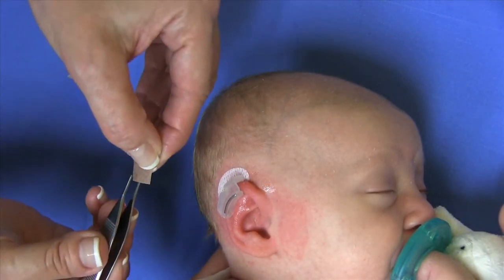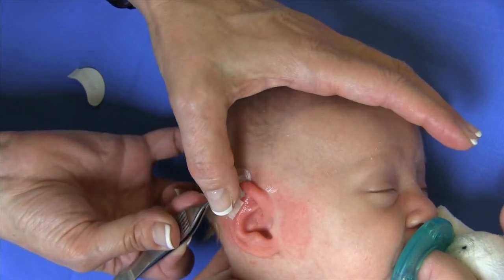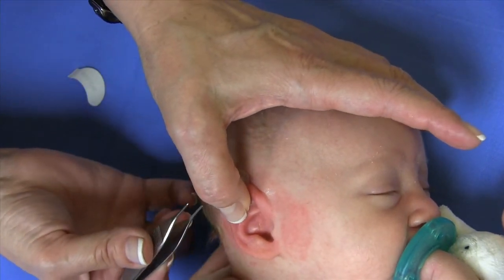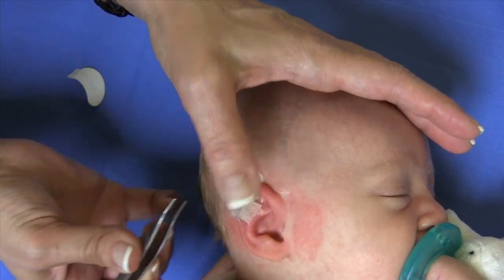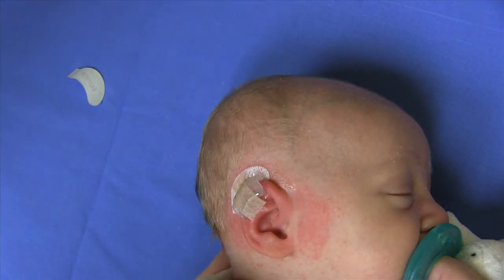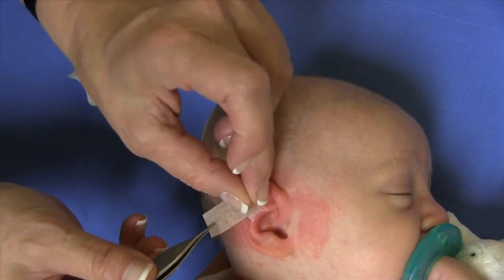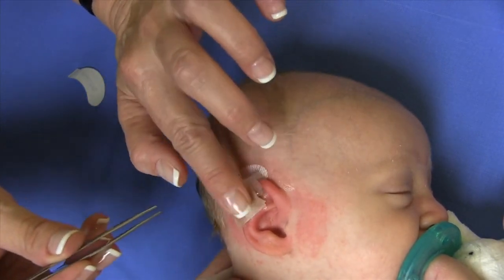I'm going to take a short piece — this would be the most important piece. If babies are moving and you get this piece in place, then you're good. So I've taped it across like that. Now you've got everything exactly in the position that you want. After that, you are just supporting that position by adding additional pieces of tape.